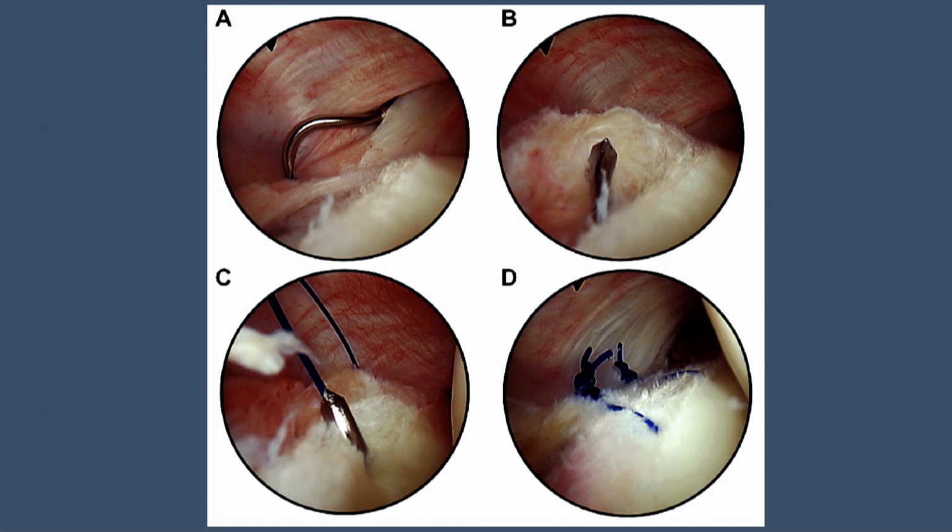People who have been doing PCL reconstruction arthroscopies are familiar with this approach and it is easy for them. So we can put a meniscal lasso or ramp lasso from the posteromedial portal and take bites through the capsule as well as the peripheral meniscus, and put a sliding knot to fix that.